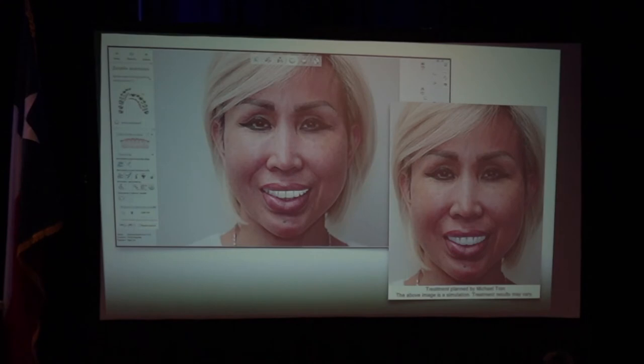You take the photo, and now we're showing this is why the photos are important. We import the photo into the CAD, the software to design it. Why I bring this up is, one, on the right side is that photo that's $48 a month. It's very, very quick that assistants can do it. But I didn't communicate, and that's what we got patient accepted.